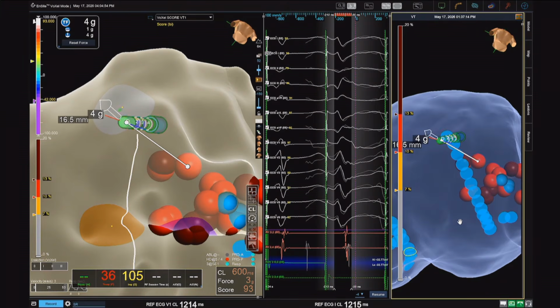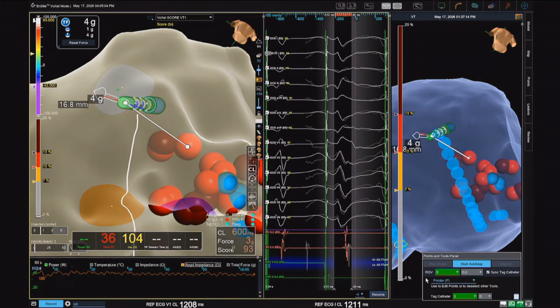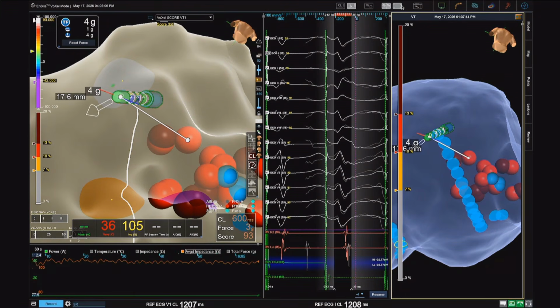So it's the same VT using just one channel, one with a lateral exit, this one, and one with a post-septal exit, the VT number 3, 4. So we are going to ablate this region. Show me the wall thickness map again. Can we increase to 40 watts because I have less contact here, please?